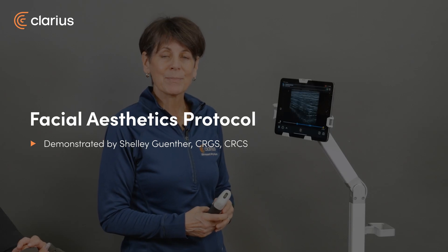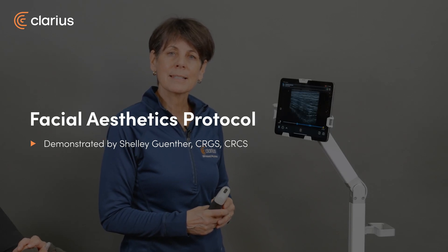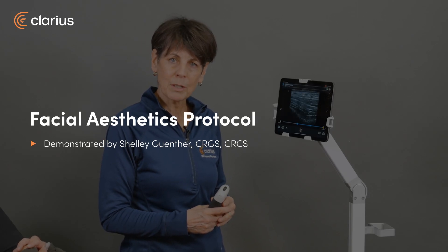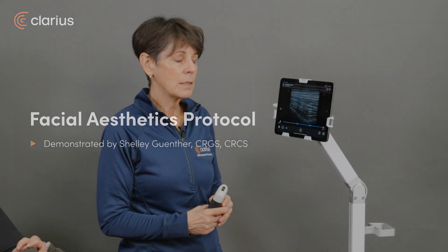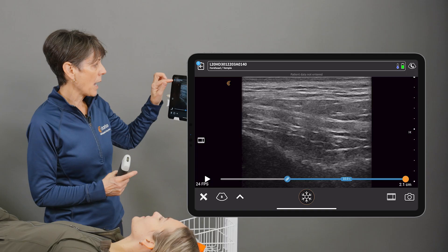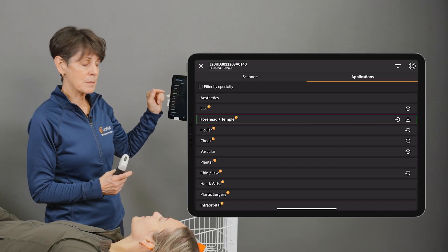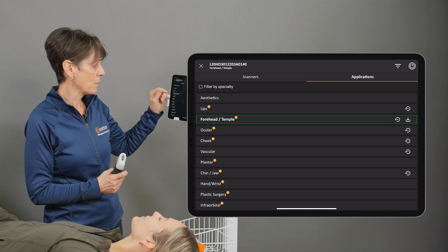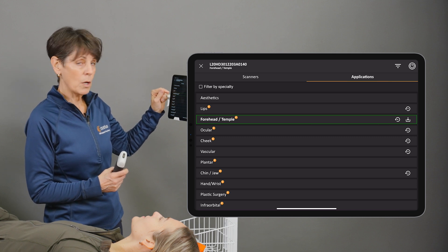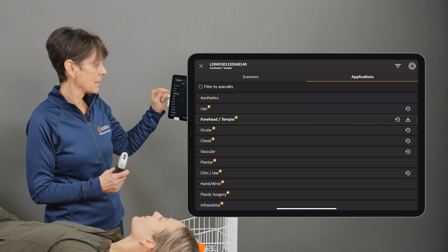Hi, my name is Shelley and today I'm going to tell you about the aesthetics protocol on the Clarius app. For those of you that are familiar with the app, you know that we have some nice custom presets for all parts of the face for aesthetics.